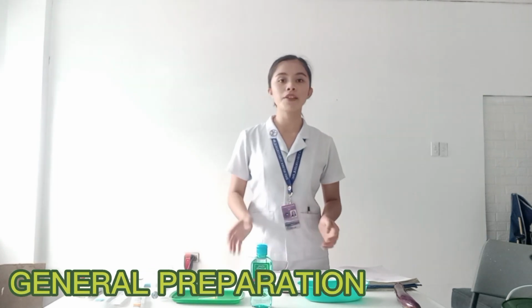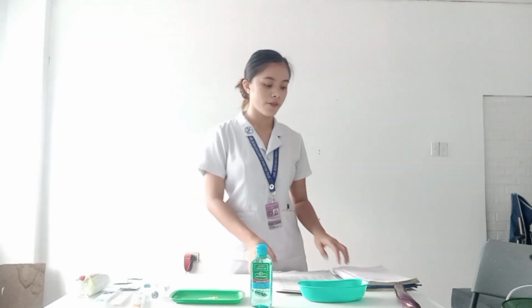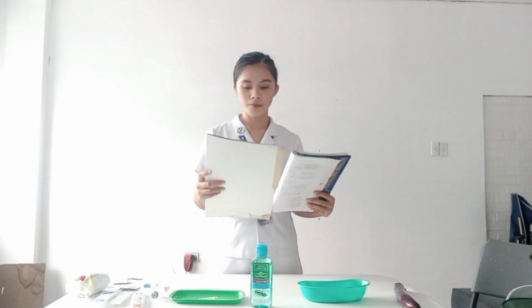Before we proceed with the actual demonstration of the administration of the medication, the first thing we want to do is to check the doctor's order and the medication administration record. This is done so that we will be able to identify what drug is to be given to the patient. After that, we have to check the label on the medication against the MAR to make sure that the correct medication is being prepared.